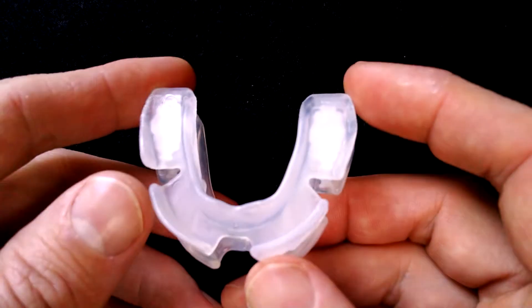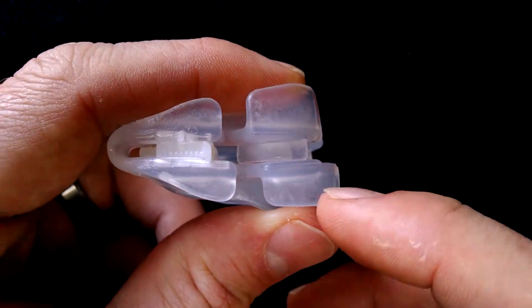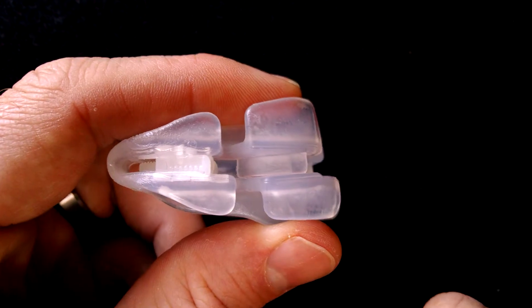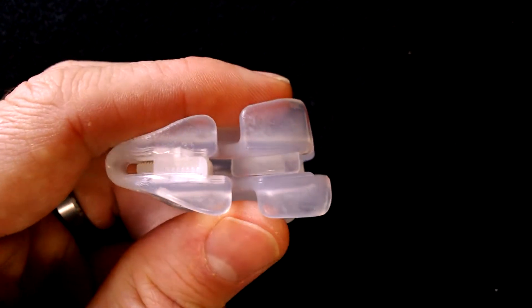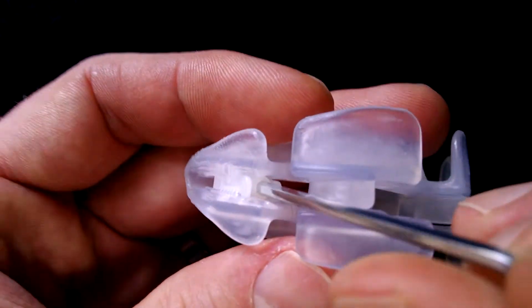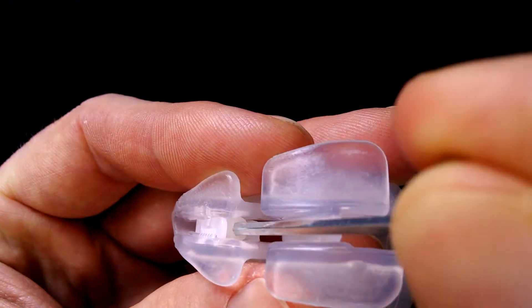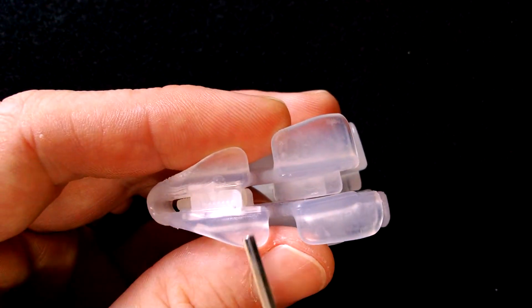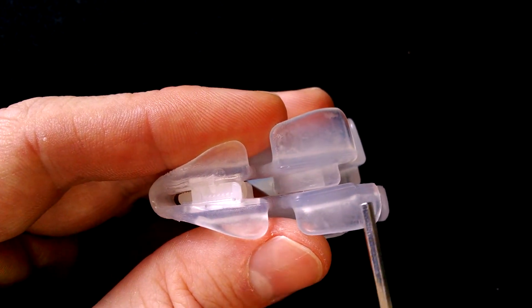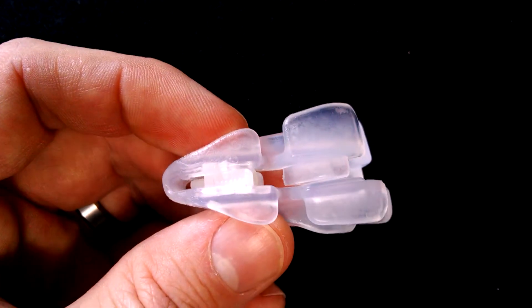The VitalSleep is a mandibular advancement device, so instead of holding the tongue forward, this is going to hold the jaw forward, and that's also going to tighten the airway and prevent snoring. This particular one is unique because it can be adjusted. You can actually adjust the advancement by putting the Allen key into this screw here and turning it — left or right — and that's going to slide this tray back and forth. That's a really nice feature to have with these mandibular advancement devices.